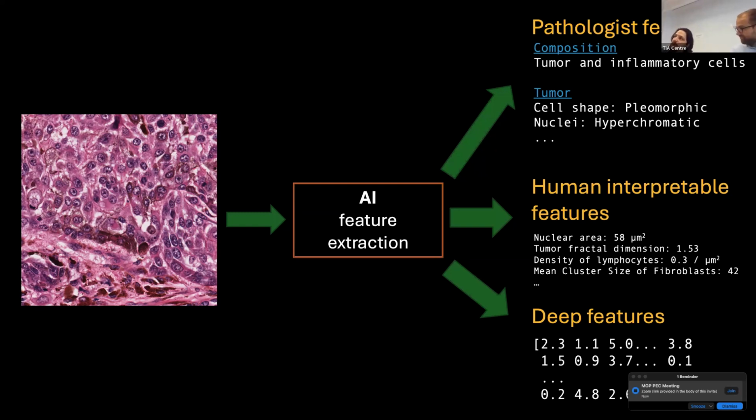I myself think that might be better because, first of all, those are interpretable, and because of the way they have been calculated, it's more controlled rather than black-boxed deep learning models. But what do you think? Do you think there are specific properties of these human interpretable features that still make them undesirable in comparison to these novel multimodal vision and language models?